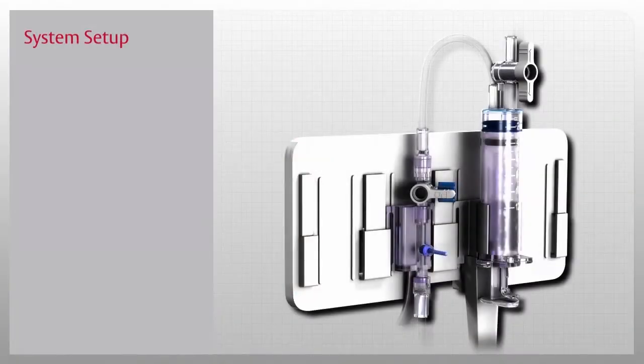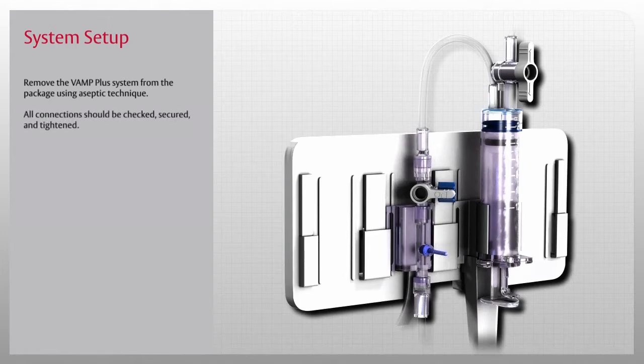Now that you've been introduced to the VAMP Plus system, let's start our in-service by setting it up. Remove the VAMP Plus system from the package using aseptic technique — all connections should be checked, secured, and tightened. Next, mount the VAMP Plus system on the IV pole, or simply set the reservoir on the bed next to the patient.